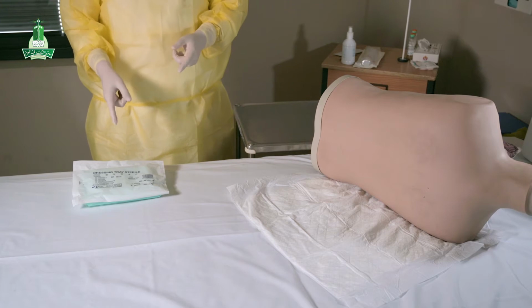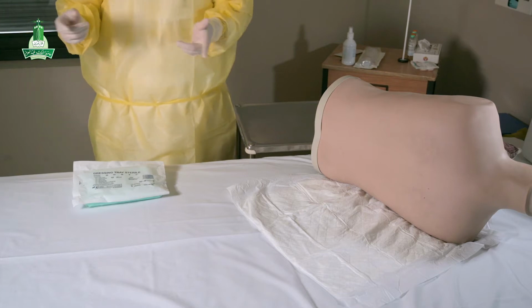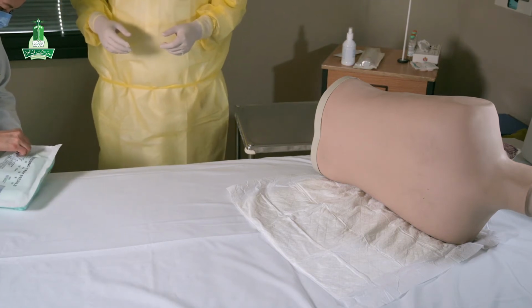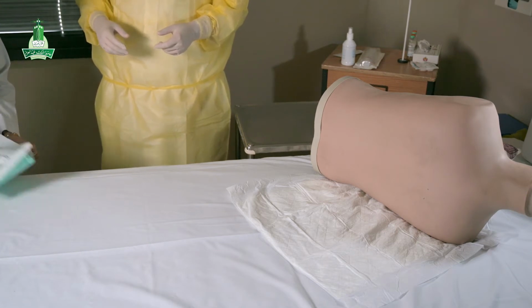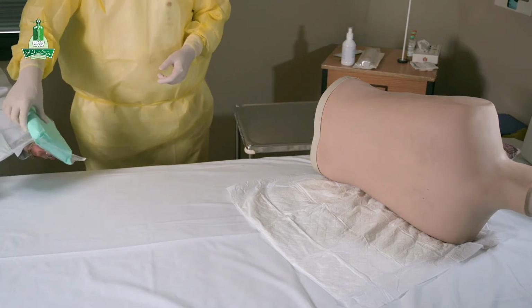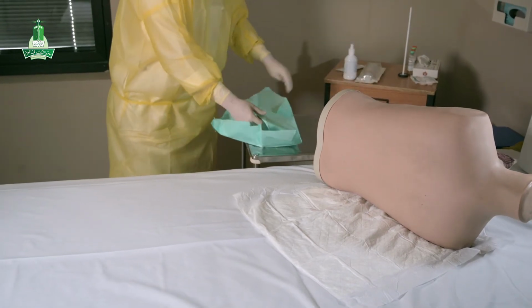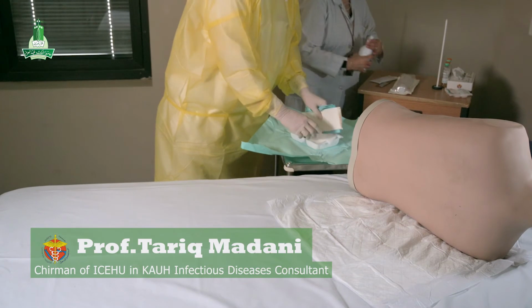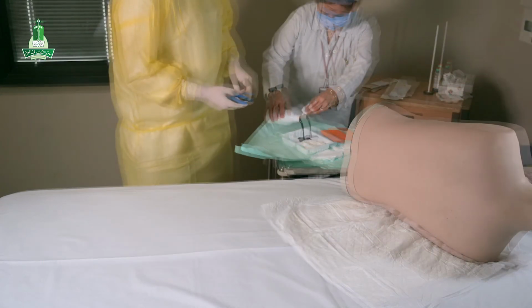Okay, now we'll open this dressing tray. Our infection control team leader, Madani, will help me doing the procedure. So please, Madani, open the sterile dressing tray. Okay, now this is sterile. I'll take the sterile part from the envelope and open it. Now, I'll ask Madani to pour some povidone iodine, please. Some povidone iodine here. Enough.